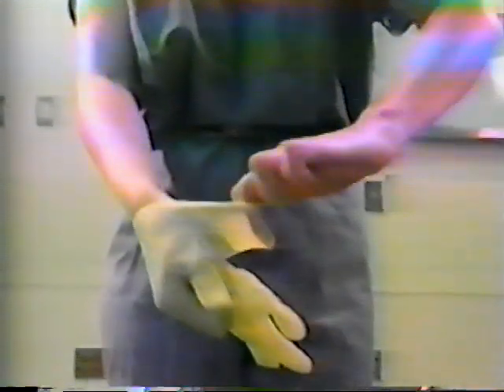To remove the gloves, the wearer can use a glove-to-glove and then the skin-to-skin technique. This approach protects the hands from the contaminated glove. The wearer grasps under the cuff of the left glove with gloved fingers of the right hand and pulls it off inside out. They slip the ungloved fingers of the left hand inside the right glove and then slip it off inside out. They discard the gloves in the appropriate receptacle and wash their hands with soap and water.